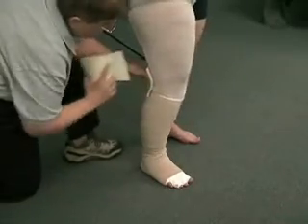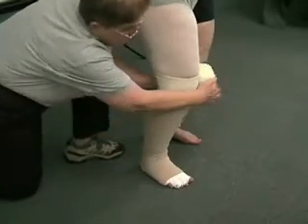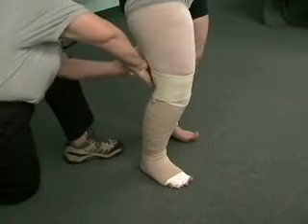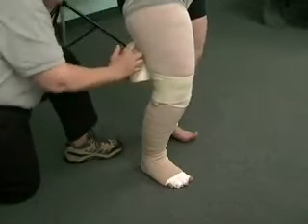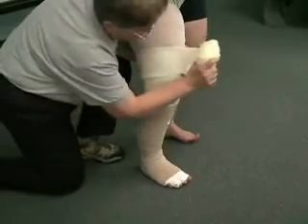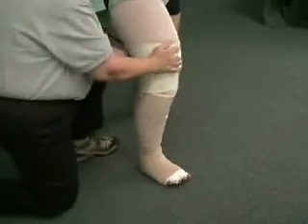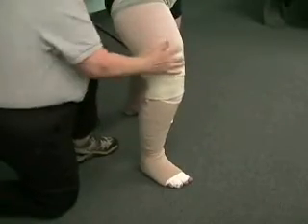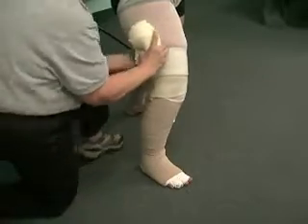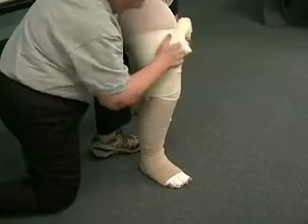Bend your knee. So I can end this way. I mean, I can begin this way, or I could go all the way up with my padding. Now, watch the Rosidal soft. Yeah, you have to have them against the table. And I really sweat when I do this because this is a lot of work. What's happening to her thigh? It's firming it up.